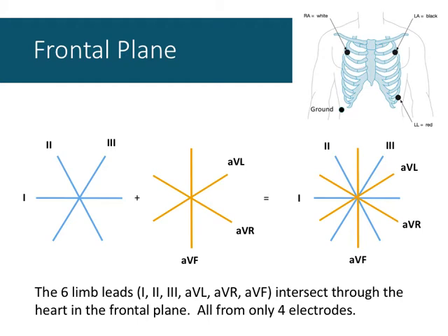So we have augmented voltage leads? Yes. What do you call the ones that aren't augmented voltage? Just leads? True leads? Or? Yeah. So the augmented voltage leads have a name because we're using a composite from 2 actual leads to create that vector. The other physical ones I would just call leads. Yeah, real leads or true leads. Never really thought about distinguishing them, but yeah, they are just leads. And I'll make it obvious if it's ever on a midterm, for example, that I mean the real ones with the point-to-point electrode connection.